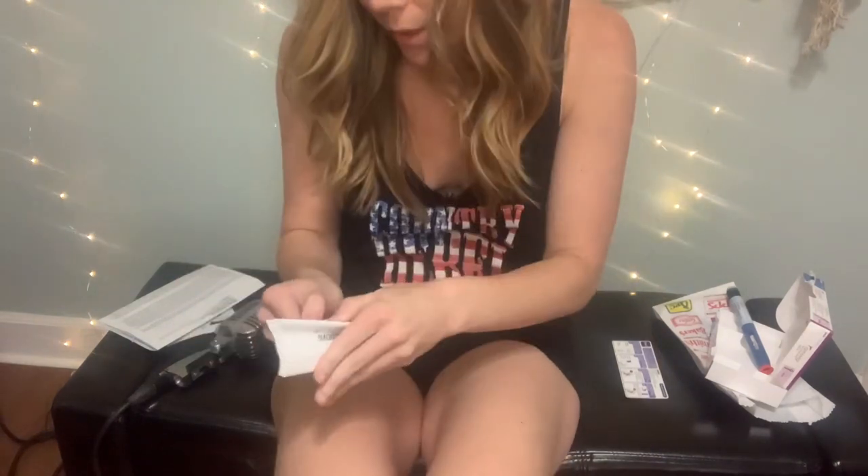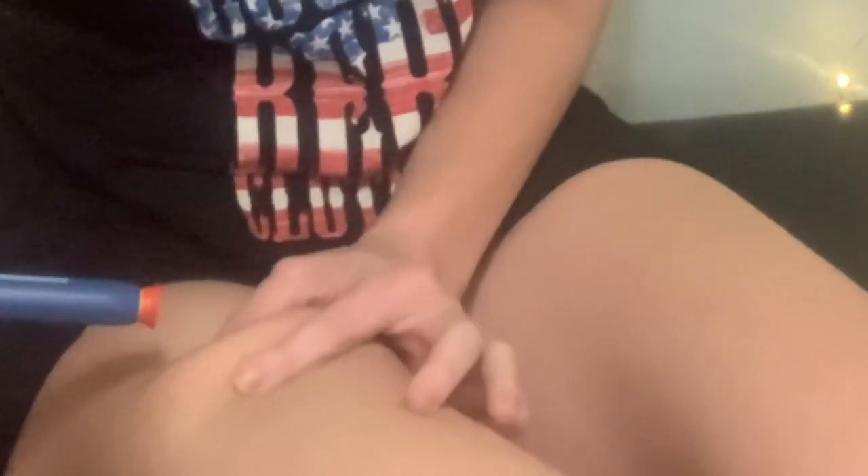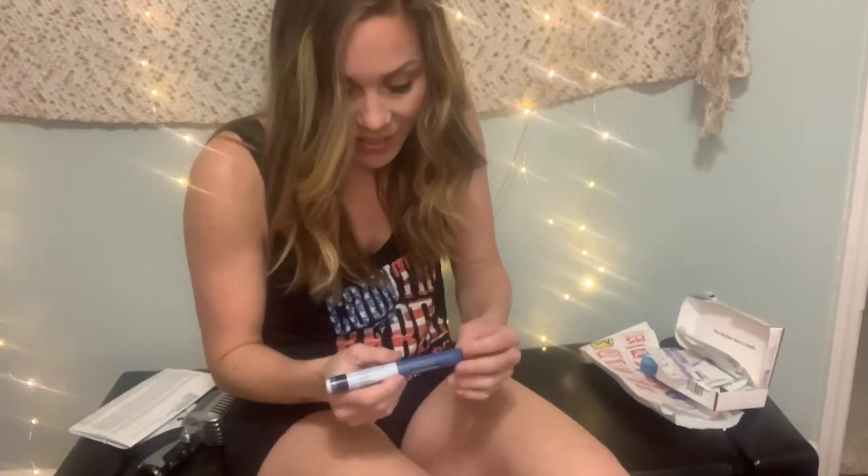I'm going to go ahead and show you guys how I do this, so I'm going to clean my leg off and then we'll get started. I'm not going to lie, I'm feeling a little worried — it'll be fine, I've done this before. Here we go. I'm literally stretching my skin out where I'm going to inject. They said you could pinch it as well, but I think I'd rather just stretch. Every month I do this I psyche myself out — it's really not bad, I just psyche myself out. I'm going to try to let you guys see this clear area right here, because when I'm done it'll turn yellow.